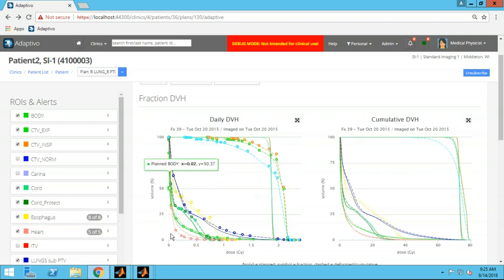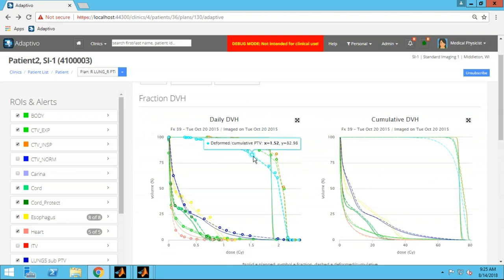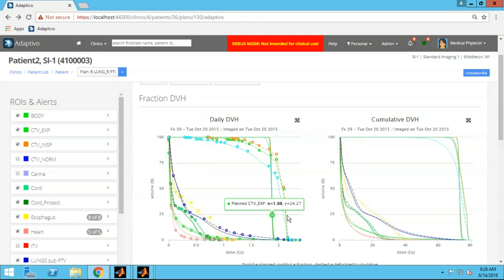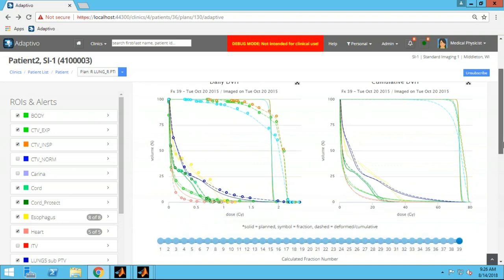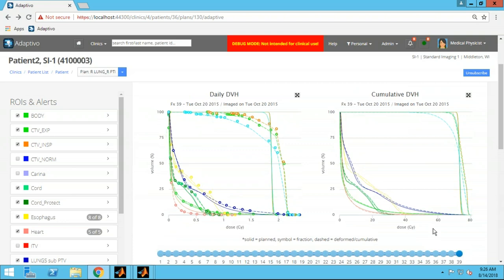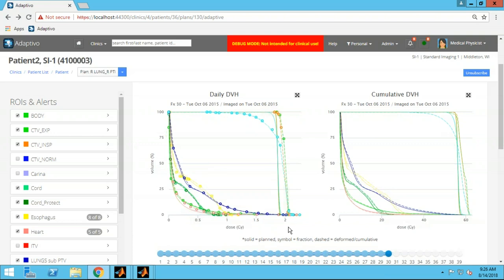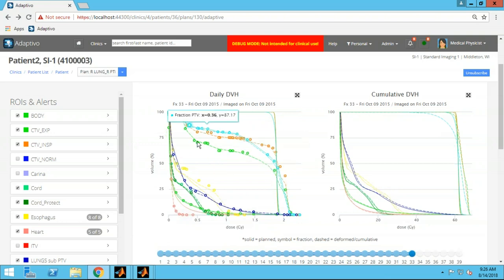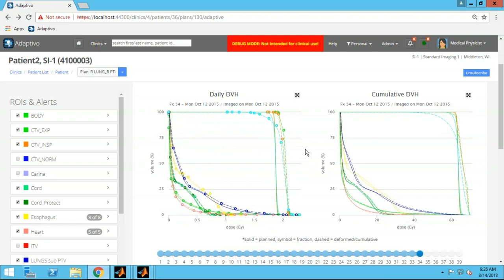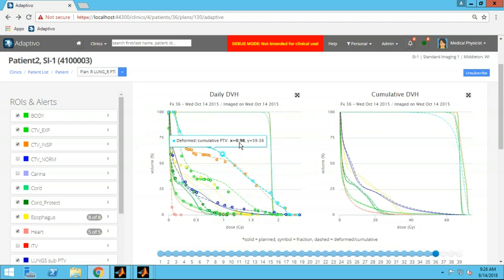Under adaptive, you first see the DVHs. The daily DVH on the left shows circles for the daily dose calculated on that daily cone beam CT, a dashed line for that dose mapped back to the planning image, and a solid line for the plan — so you have that reference to compare to. If you have a good deformation, those two should overlay. On the right is the cumulative DVH, showing the DVH up to and through the most recently delivered fraction. The solid line is the plan scaled to however many fractions have been delivered, and the dashed line is the summation of those daily doses — the cumulative delivered dose.